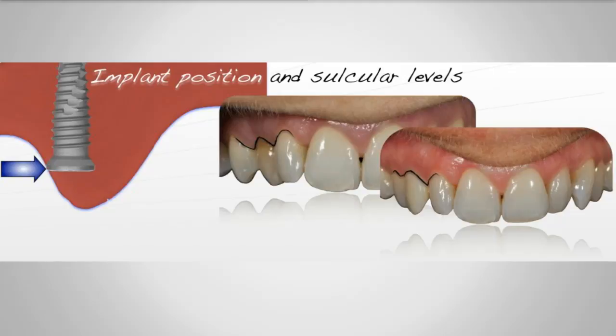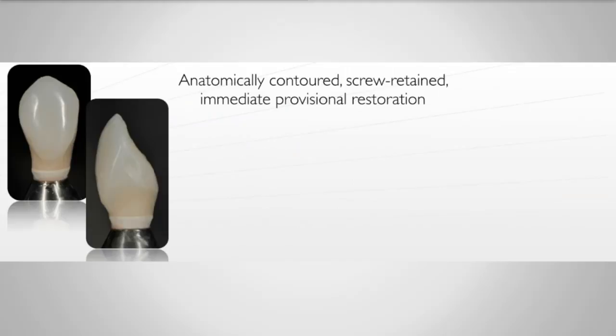All right, so now you can see that the soft tissue levels are much more coincident. How long does it take to do this technique? I can typically do it in about half an hour. In Angela's case, I spent probably 40 minutes or so because I really wanted to refine this apical or subgingival portion to get that soft tissue looking as ideally as possible. And I wanted to copy the contours of that contralateral canine as closely as I could as well.